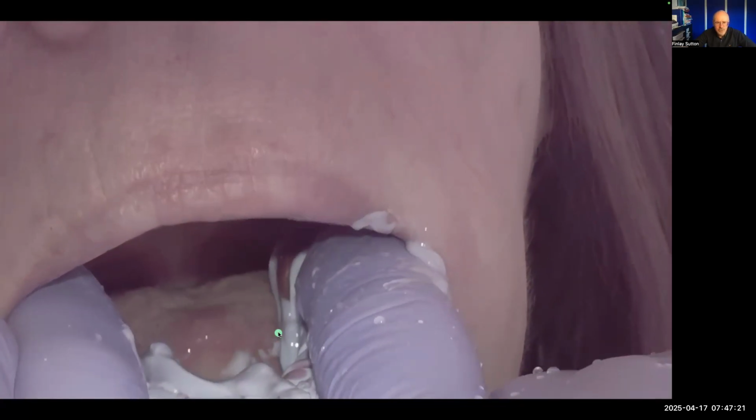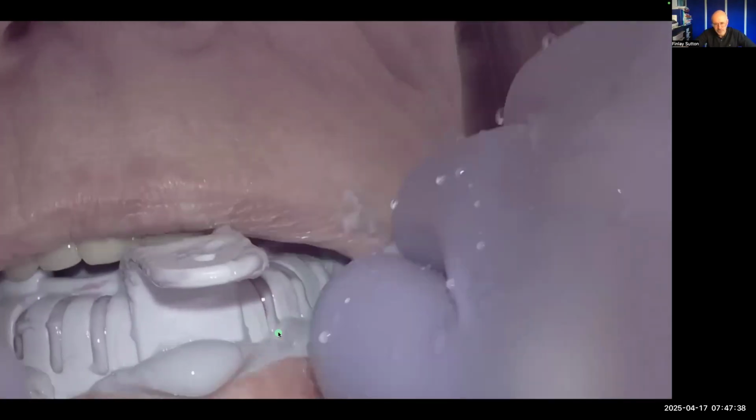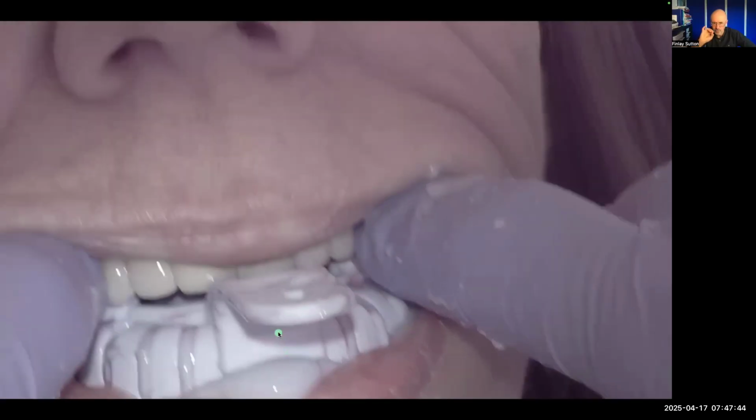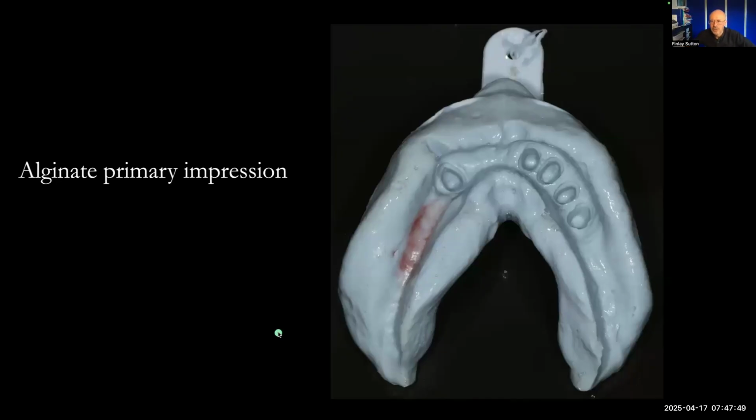Really importantly, when I'm sitting it down, you ask the patient to lift up their tongue. I want the tongue out of the way, so lift it up, Jackie, like that, and then just rest your tongue. That gets it out of the way. Then gently close together and do a little bit of border moulding, but it's really not important. It still produces a lovely impression specifically for producing a really good custom tray. You can see we've got a lovely impression, even all these crown margins too.